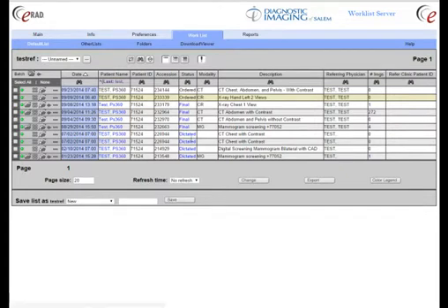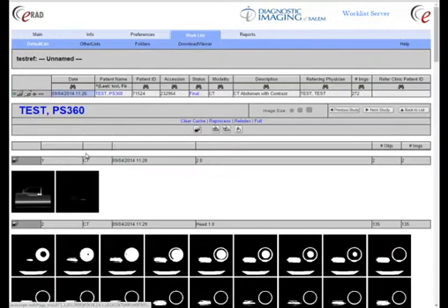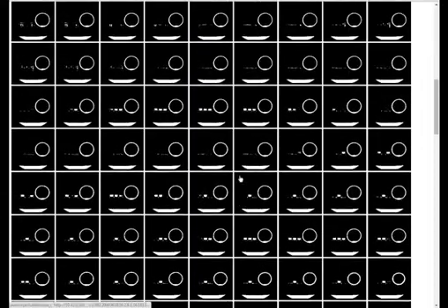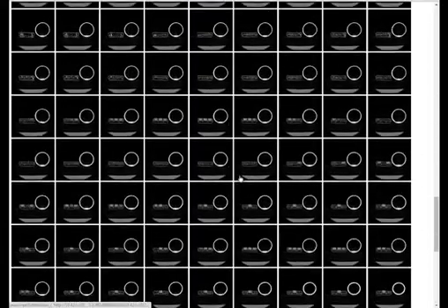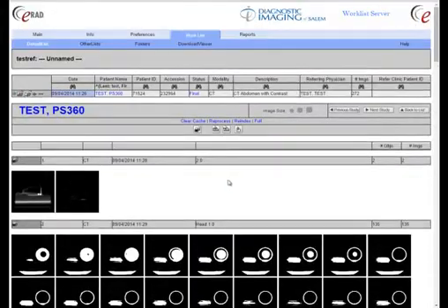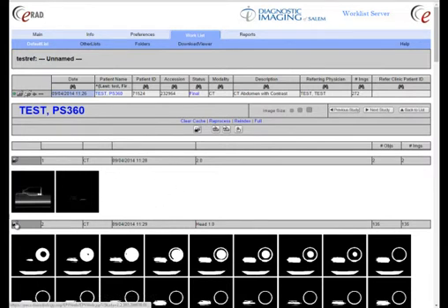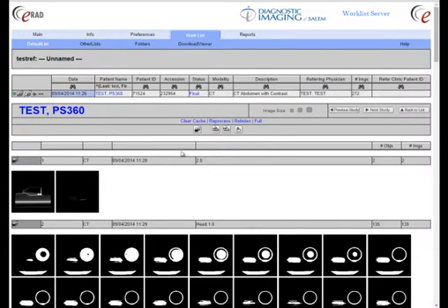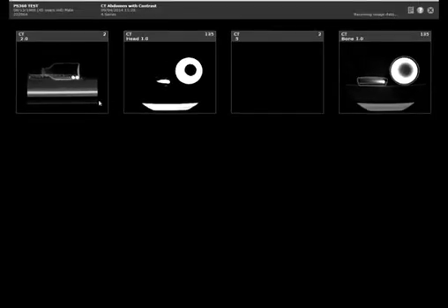Now I've found the patient I want. I can come over here and use Quick View, which is the four-square icon. I'm going to make sure I'm on one that has some images — I'll quick view this CT. So I opened the quick view; it's a bit of an ugly view showing all the series broken out into individual images. I can open a series from here, or even better, go to the top and say 'Open this study', which opens it into the zero-footprint, no-download viewer.